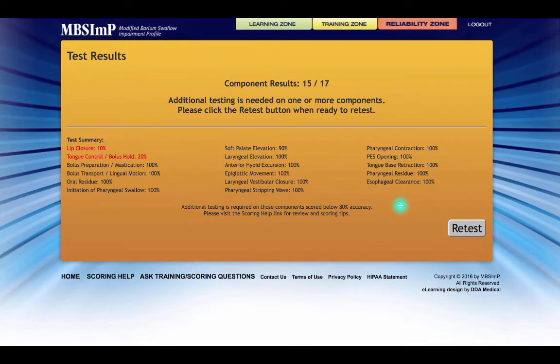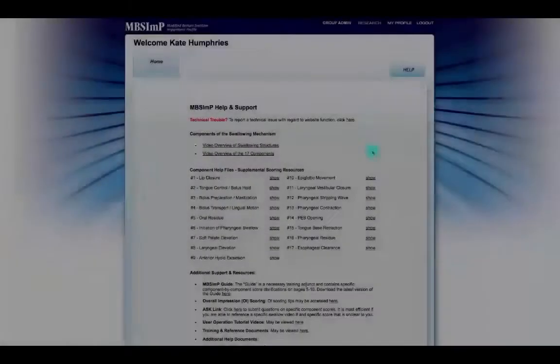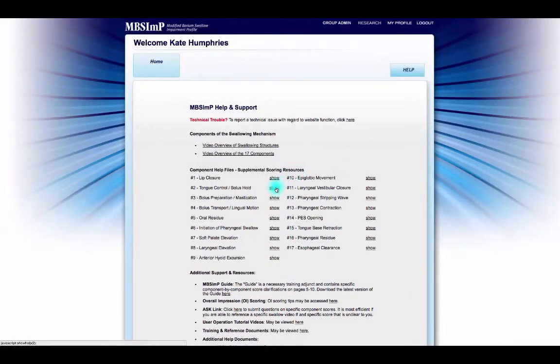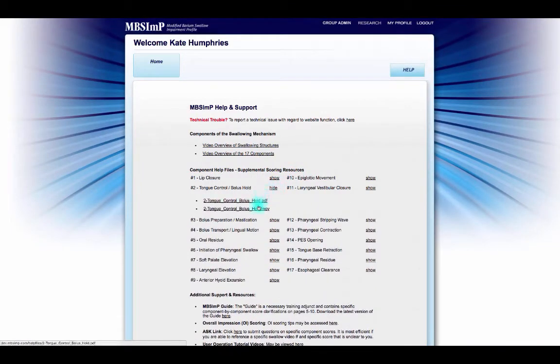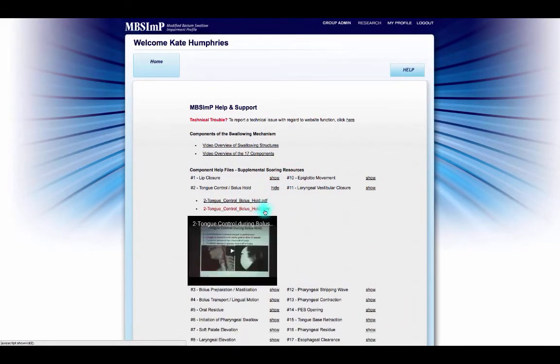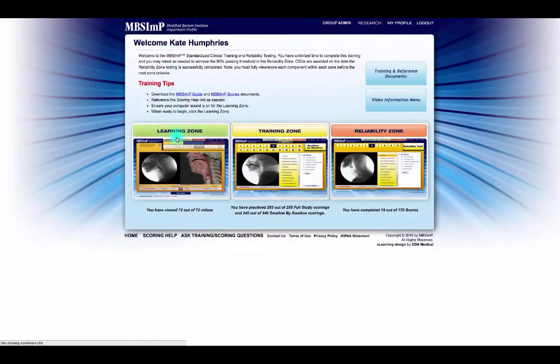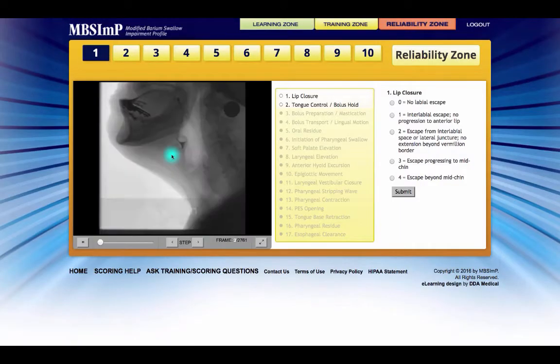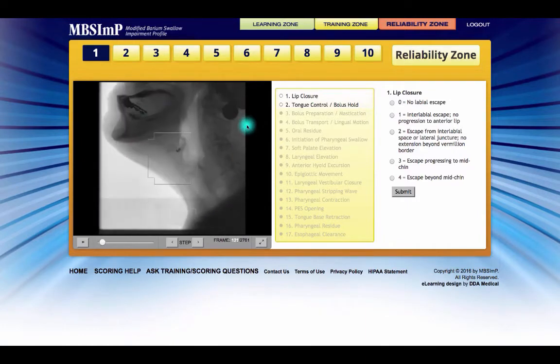If the criterion was not achieved, the notification reflects this and also includes general feedback outlining the physiologic areas that would benefit from additional study and review. It is recommended that users enter the scoring help window to review the PDF and MOV help files for each failed component. Additionally, the learning and training zones remain available for review and scoring practice. The reliability zone can be repeated as many times as needed for successful completion.